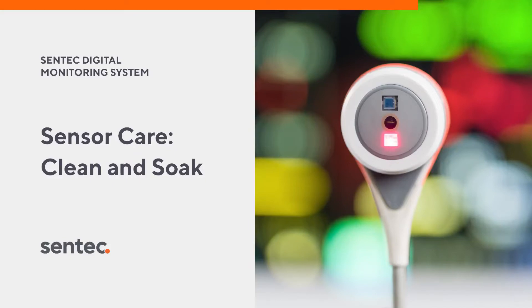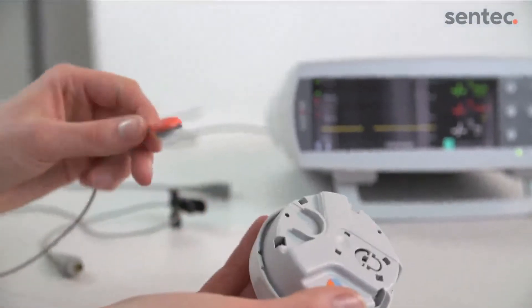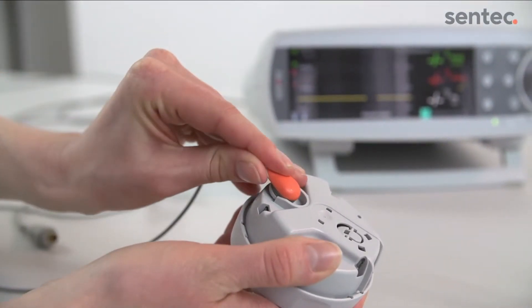Follow the next steps for a clean and soak. First, remove the old membrane from the sensor using the bottom part of the membrane changer. If the membrane does not come off easily, you can first soak the sensor with the membrane on.